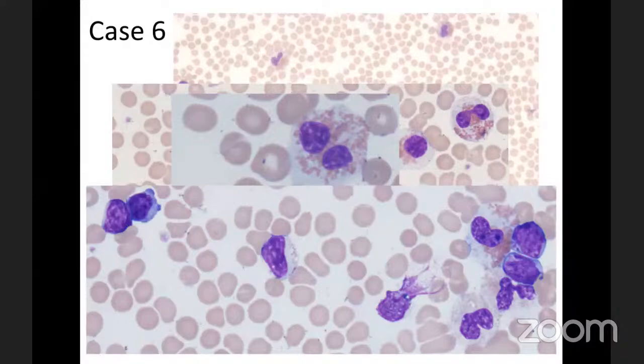So what do you think? Eosinophilia. AML could be with eosinophilia; for example, you would put in your differential AML with inversion 16 or translocation 16;16. Yes, since there is eosinophilia, but we don't have the monocytosis.